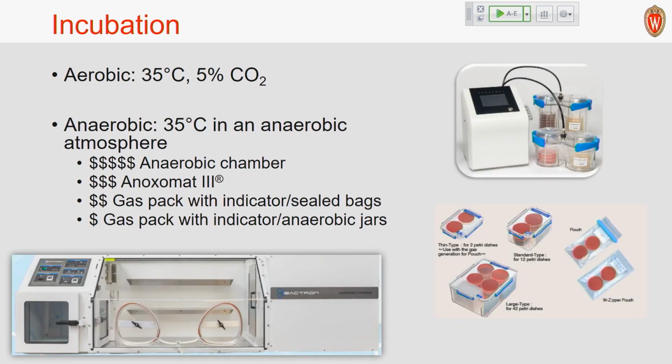Okay, so talking about the incubation conditions. For the aerobic side, of course, you need some CO2 for those fastidious CO2-loving organisms. For the anaerobic options, from the most expensive on down, I mentioned the anaerobic chamber, and it's nice, it's a gloveless thing.